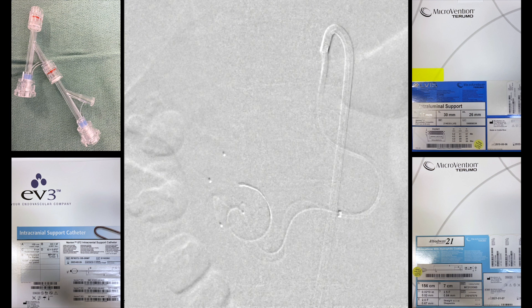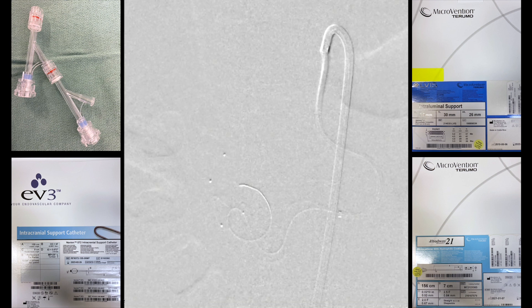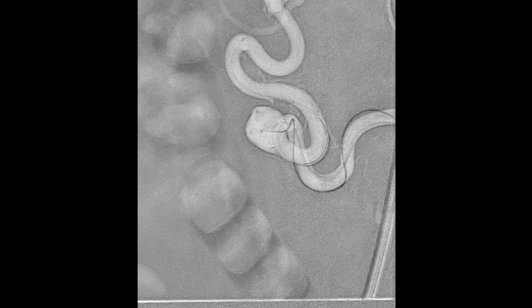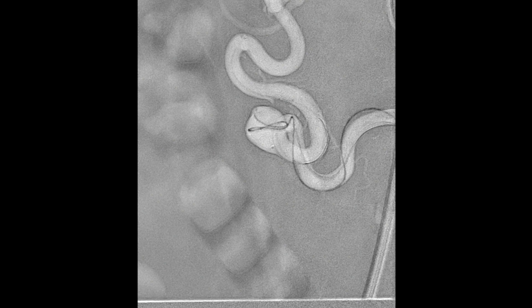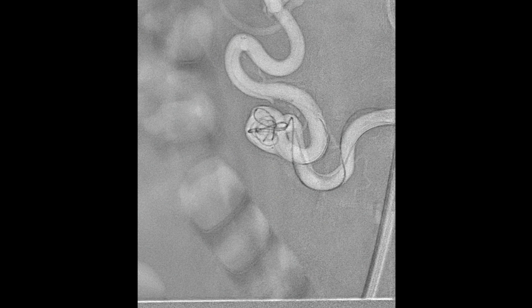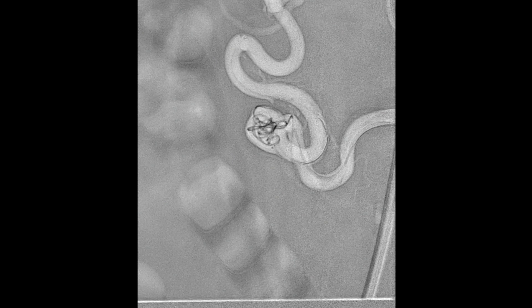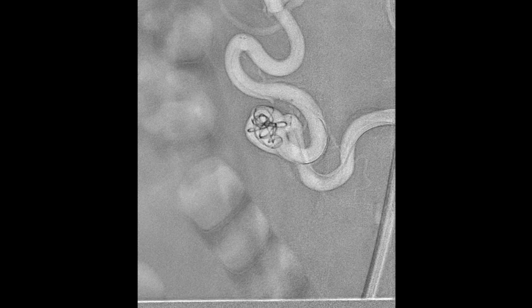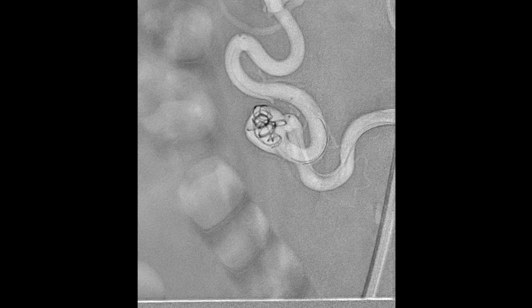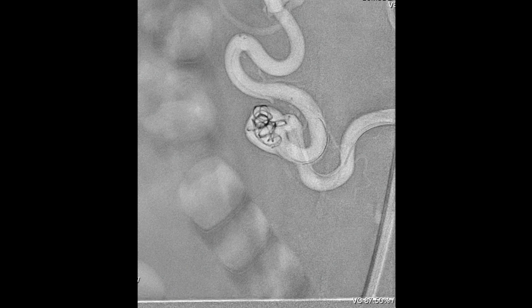We've put a list in here, but because there are a number of devices you may not be familiar with, there's another list at the end of this procedure. What we're doing now is passing these wires into the aneurysm and beyond the aneurysm. One technique is to put the stent in and trap the wire inside the aneurysm. The concern here was that because the aneurysm was on the outer aspect of the curve, we felt the stent would just prolapse into the aneurysm. So we used framing coils early to start packing the aneurysm, with the idea that once packed, the packing itself would provide support for delivery of the stent. We have a safety wire trailing beyond the aneurysm into the distal anterior division of the pancreatic duodenal artery.